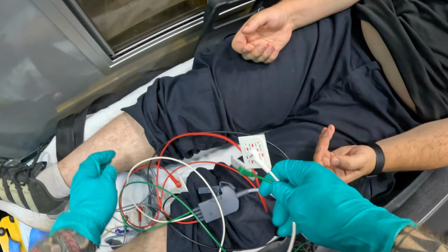So V6 is the next to be placed. Move the shirt to the side. V6, same fifth intercostal space, and it's going to be the mid-axillary line. And then V5, if he holds his hand straight down, like this, V5 is the same fifth intercostal space, but it's the anterior axillary line. Anterior axillary line is right there. So move your hand to the side. V5 goes here.